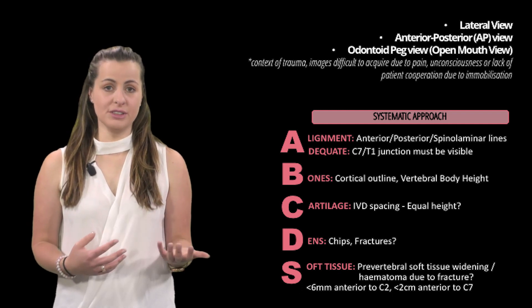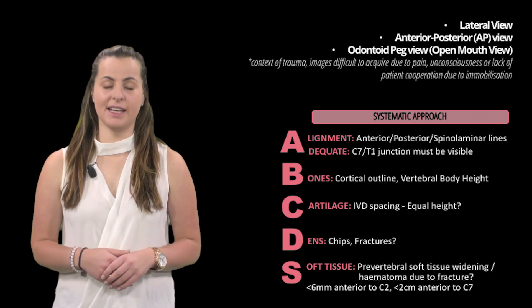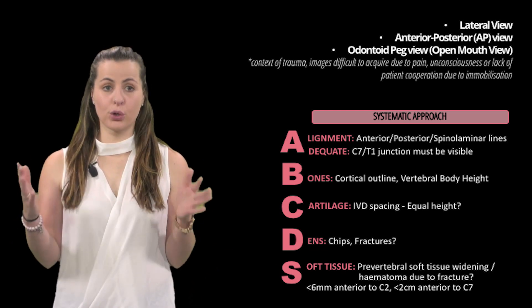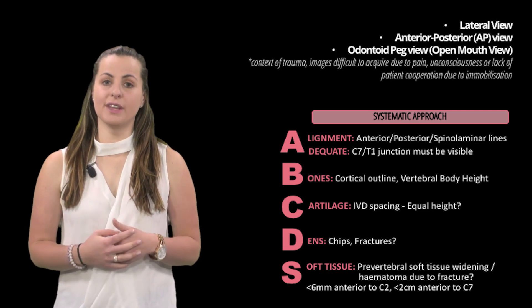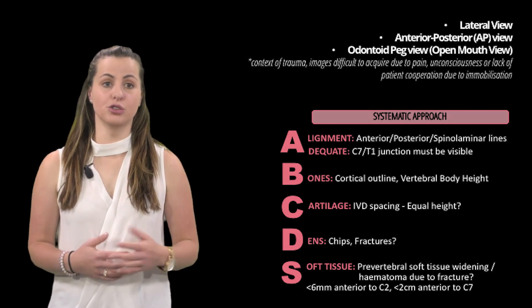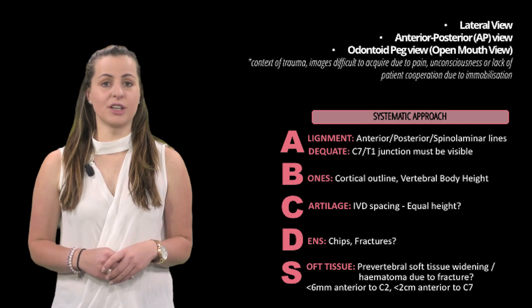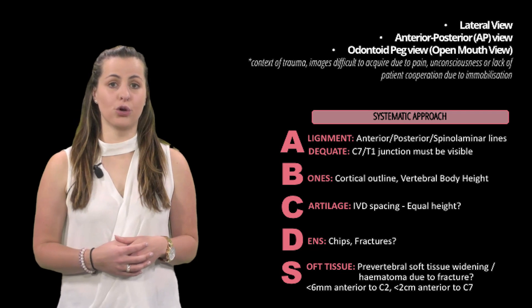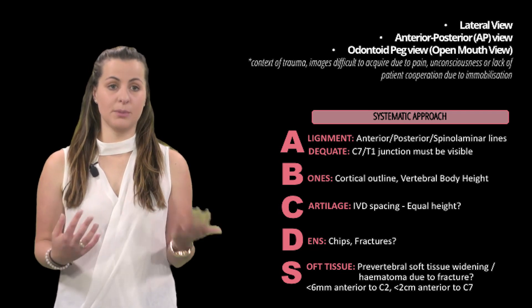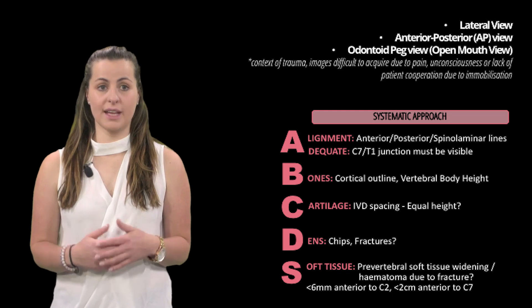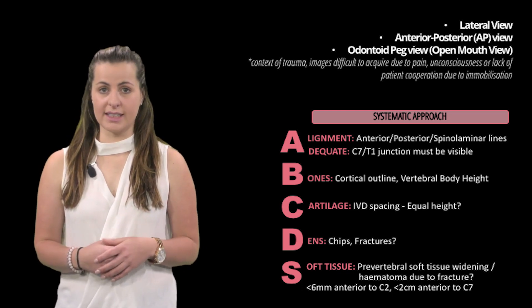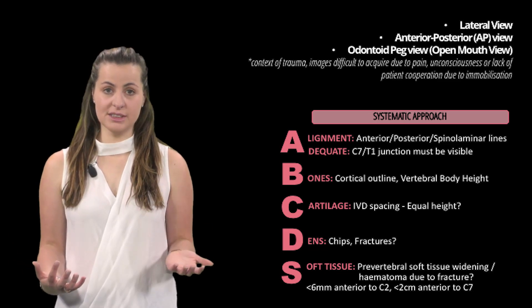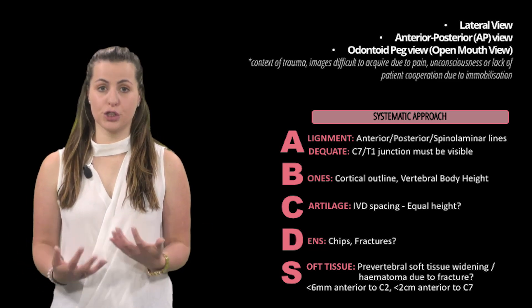Next, we assess the bones. Each vertebra must be examined for fracture, collapse, or avulsion by tracing the cortical outlines of each bone and making sure the facet joints are parallel to one another. For cartilage or intervertebral discs, these must be examined for symmetry and normality, ensuring they are of relatively equal height between each vertebra. We also need to assess the dens for chips or fractures — this is also called the odontoid process.